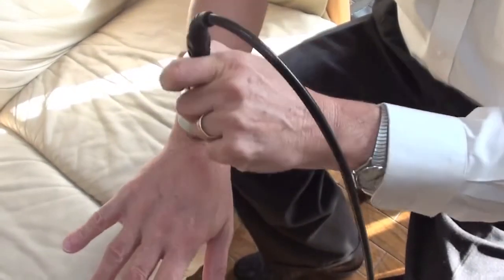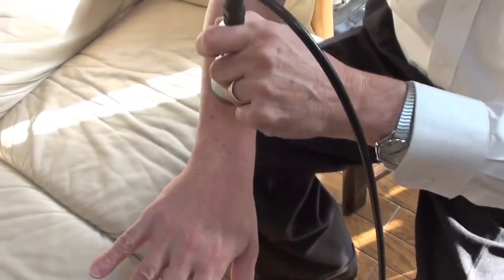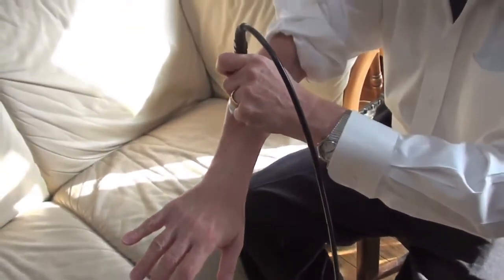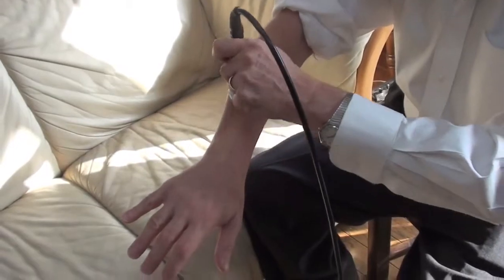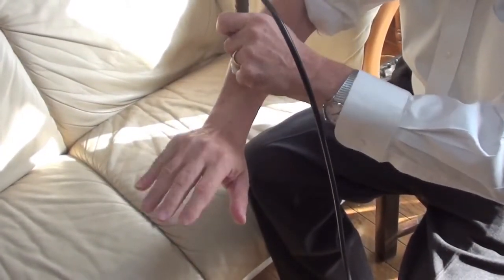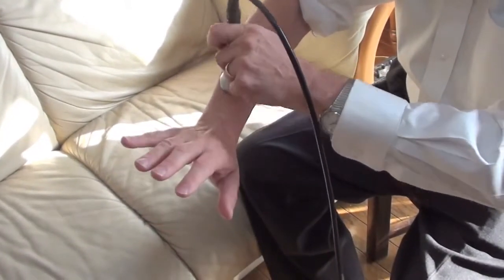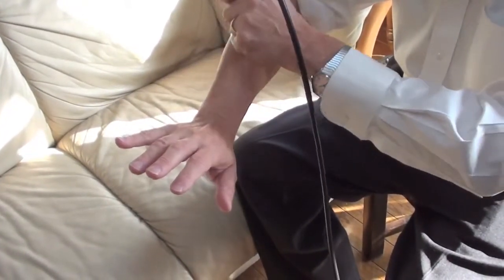The speed of using the therapy handpiece is like this — it's a painting motion. You'll feel slight warmth. If you hold it in one spot it will get very hot, so you've got to keep it moving. It's also important to get motion. So let's pretend this is the foot, the fingers or the toes — you move it back and forth.